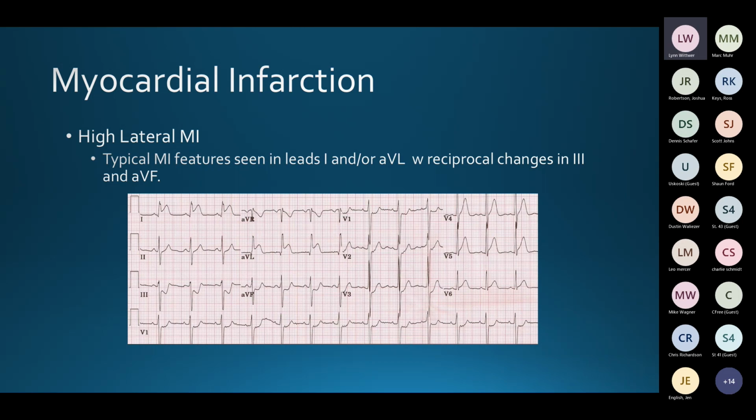But this is not typical of a STEMI. So ST elevation can occur along with the anterior or inferior STEMI, but then you're already calling it a STEMI.